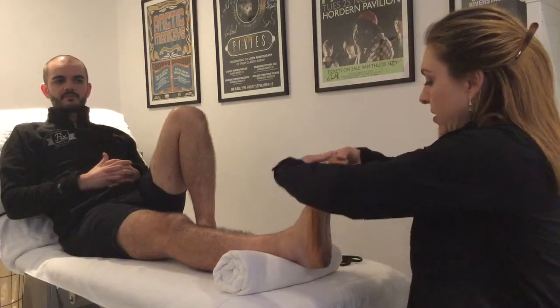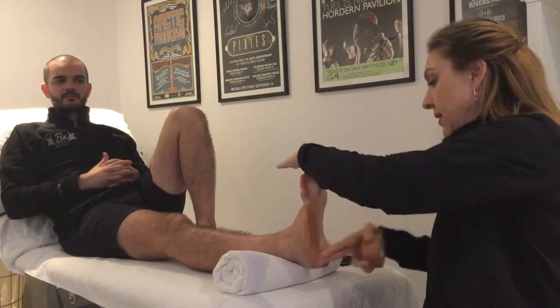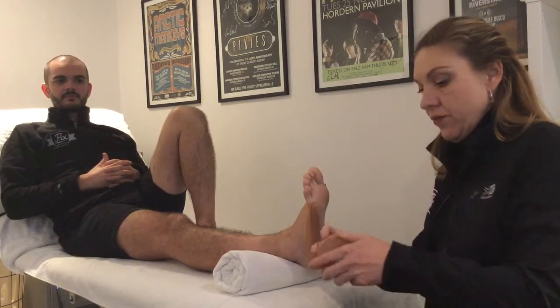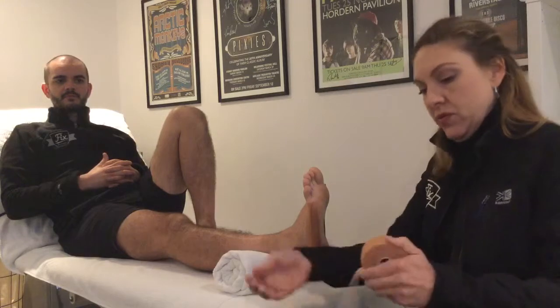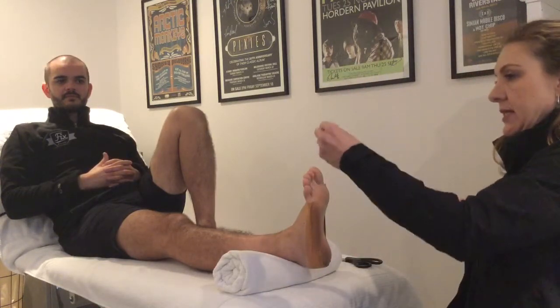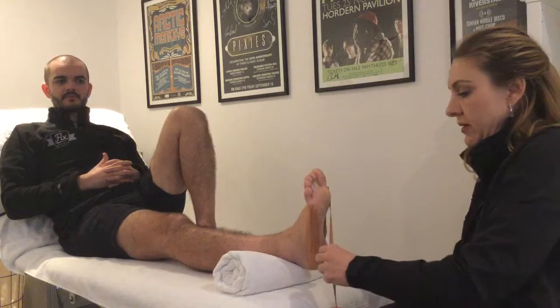That just forms an anchor for the rest of the tape. Then cut your tape in half and tear the tape longitudinally down the middle. With this tape, we start at the first metatarsal head — the part on the big toe side.